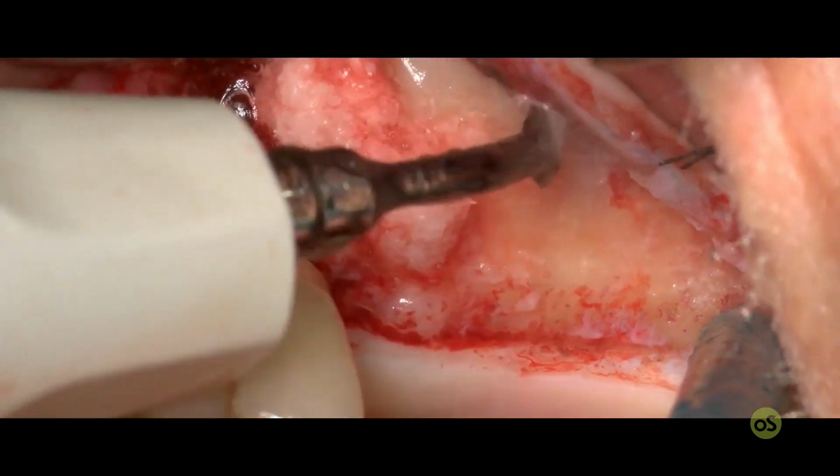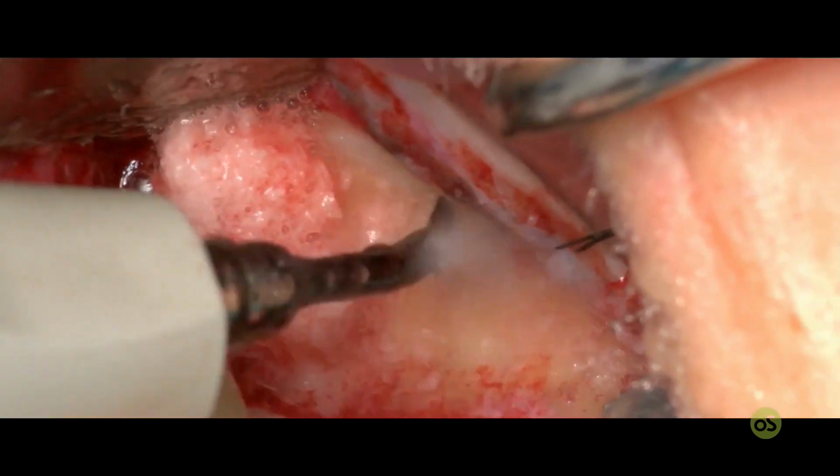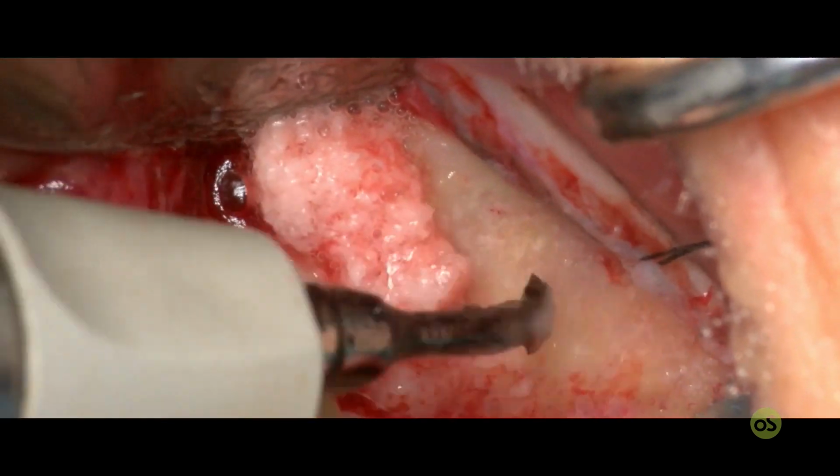The device is set at the lowest level of irrigation in order to avoid losing the particles.